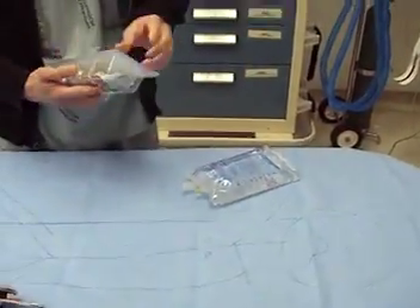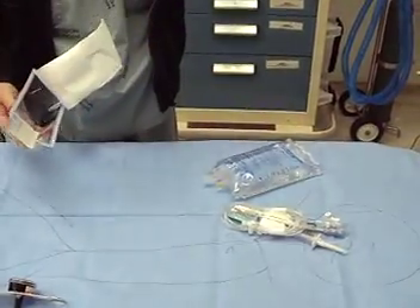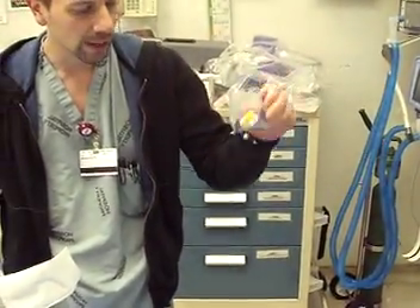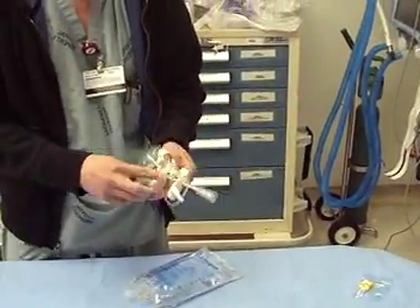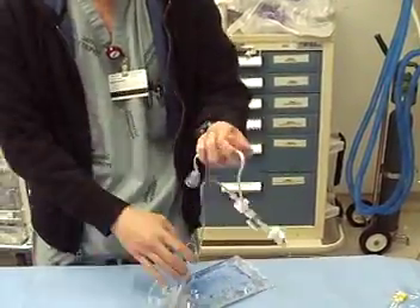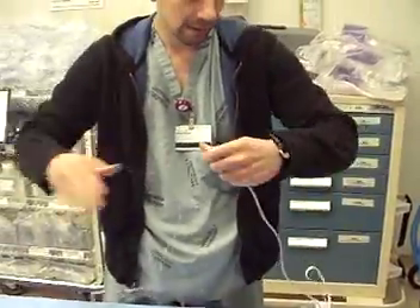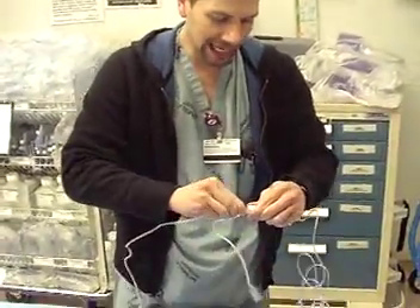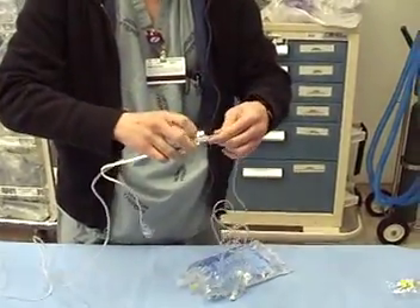Open up your bag. Open up your TransPak set. These little yellow caps — don't throw those away. What you're going to do first is break off this little white piece that's keeping it together for packing. What I like to do is unfurl it, and actually make sure all the connections are tight. Sometimes during packing they come loose and then you have fluids running everywhere.